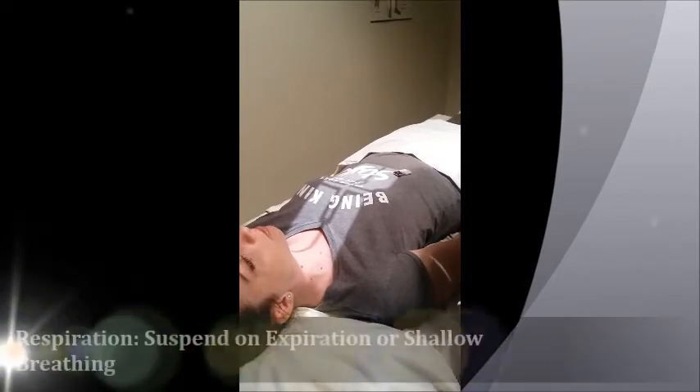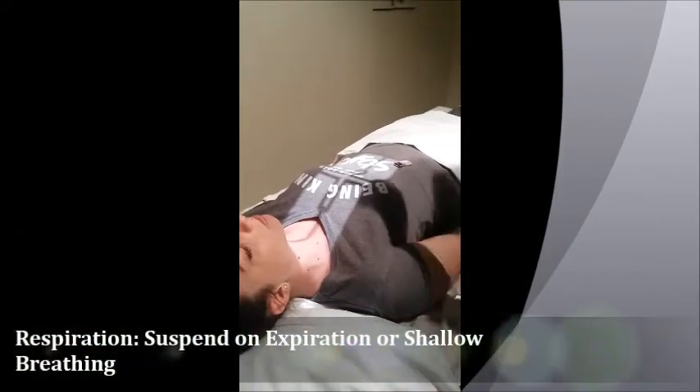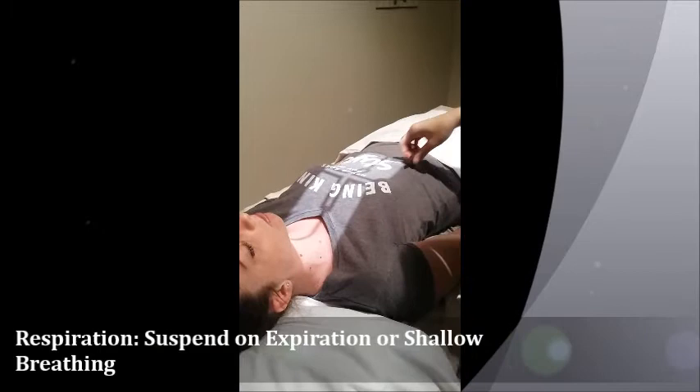Her breathing is going to be shallow normal breathing, or it's going to be on suspended expiration. Okay, so that was for the AP.